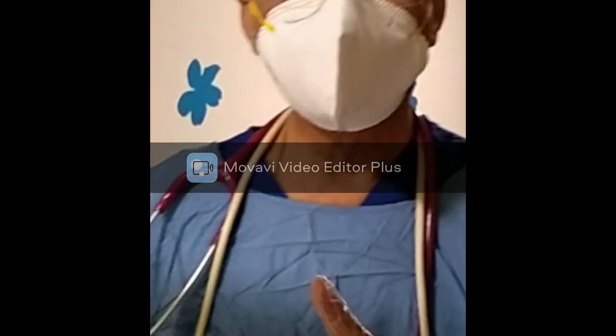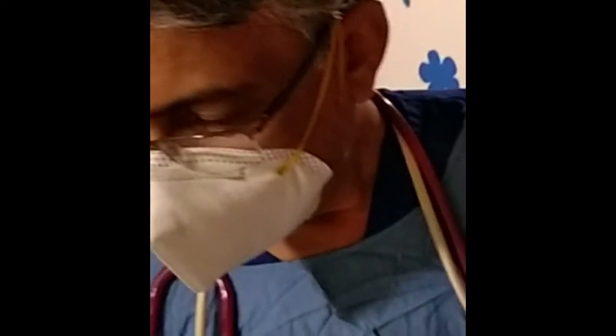Another parameter we use to derive left ventricular function is Simpson's biplane method, where the probe is kept in the apical area again.